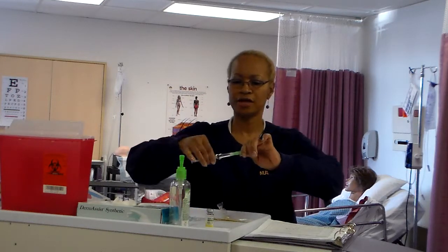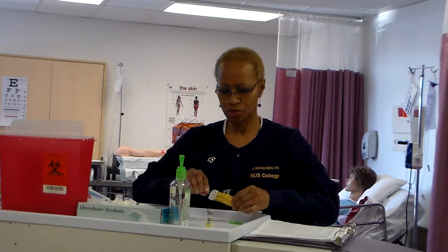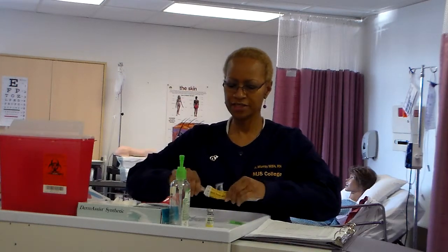Cover the needle with its safety sheath or scoop the needle to recap. So you never recap. What you're going to do is scoop, one-hand method, making sure you keep your other hand away until the needle is actually in the cap. Then you can use your other hand. Remove that filter needle, and put on the needle that you're going to deliver the medication with.